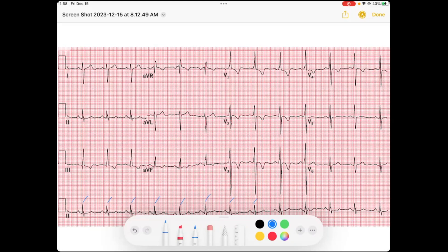We'll find a QRS that is right on the solid line and count the rate as 300, 150, 100, 75 — maybe a little under 75, maybe 72 beats per minute. It's pretty narrow and pretty regular.